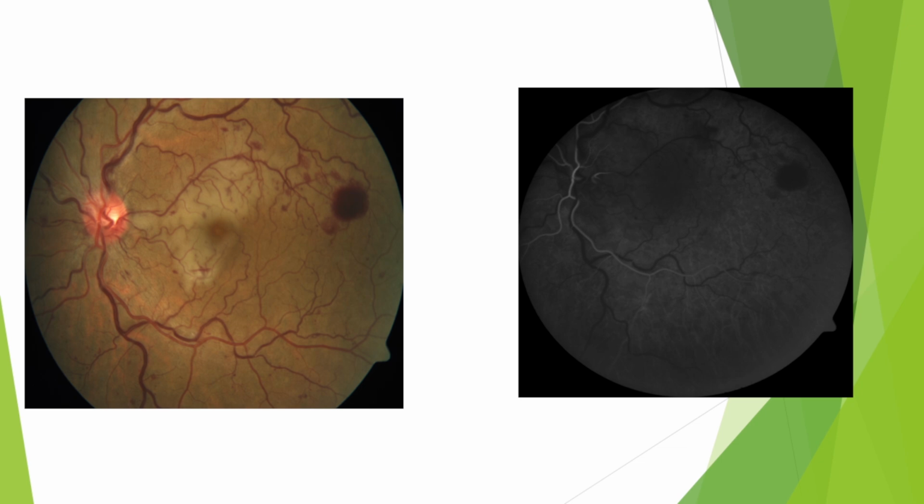Ciliary. So that vessel is not filling even in the AV phase. Don't you think that's a problem? Yes, ma'am. When you bring these cases, make sure that you describe them properly. Okay, proceed.